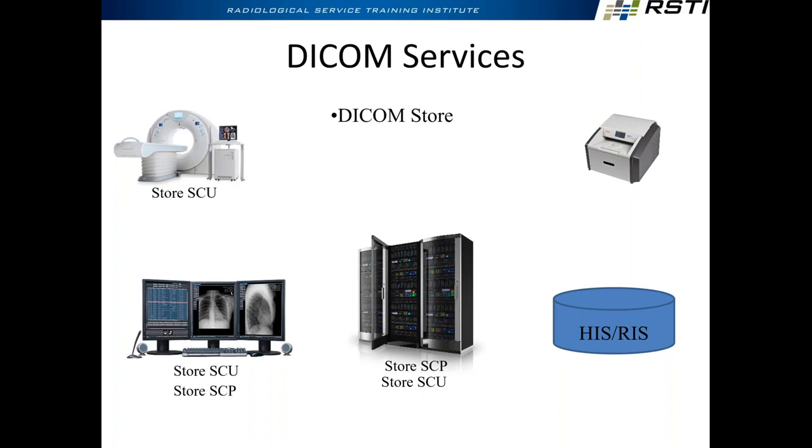What's an instance where the PACS needs to send images somewhere else? Think of anything? We send it to others. Off-site storage, different facility, long-term storage, backup solutions, all those things. So there are instances where the PACS needs to send images somewhere else, and there it would be an SCU for that particular conversation.